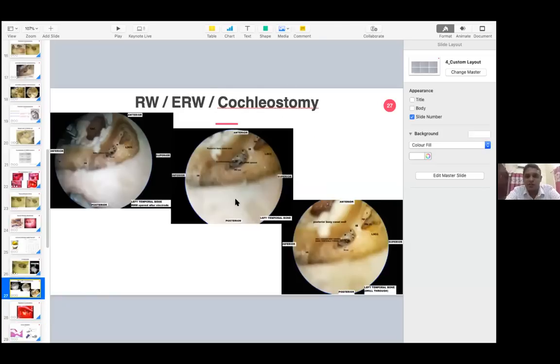In any given situation, first and foremost you identify the round window membrane. After identifying the round window membrane, go 1 to 1.25 millimeters inferior to the round window membrane inferior margin and a little bit anterior. So inferior and anterior, approximately 1 to 1.25 millimeters below the round window membrane, is the site for conventional cochleostomy. That is the answer to the first question.